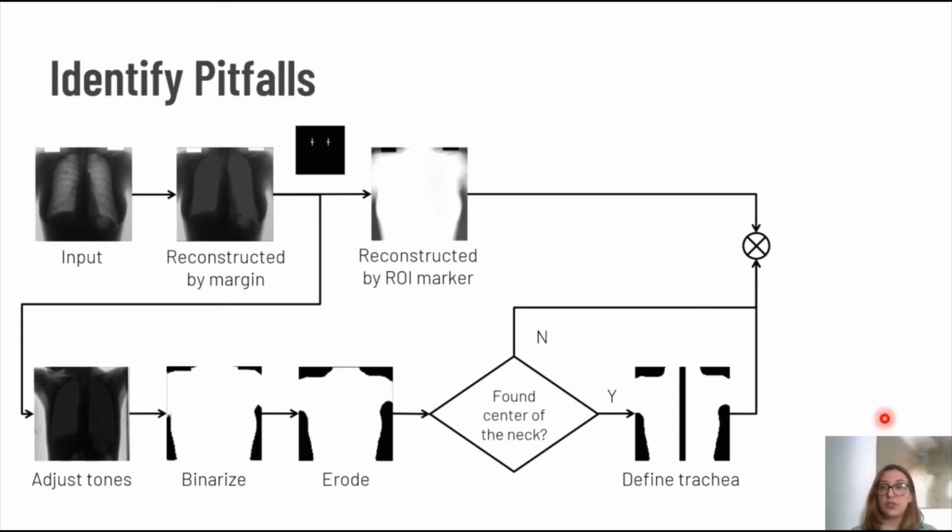That position was considered through observation based on the datasets that we chose. To identify the neck, we apply a histogram projection on a vertical axis, so that when the tone curve starts rising, that means that we are starting to reach the patient's body, the foreground pixels, and then we can remove any part of the image before that.